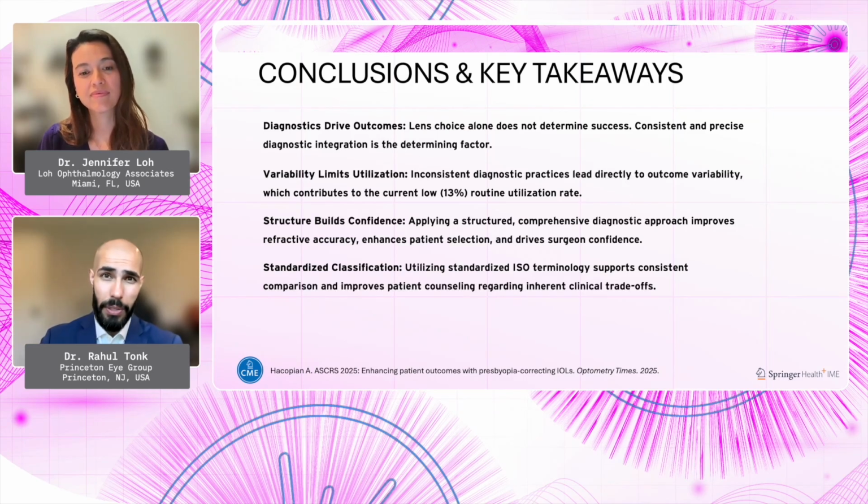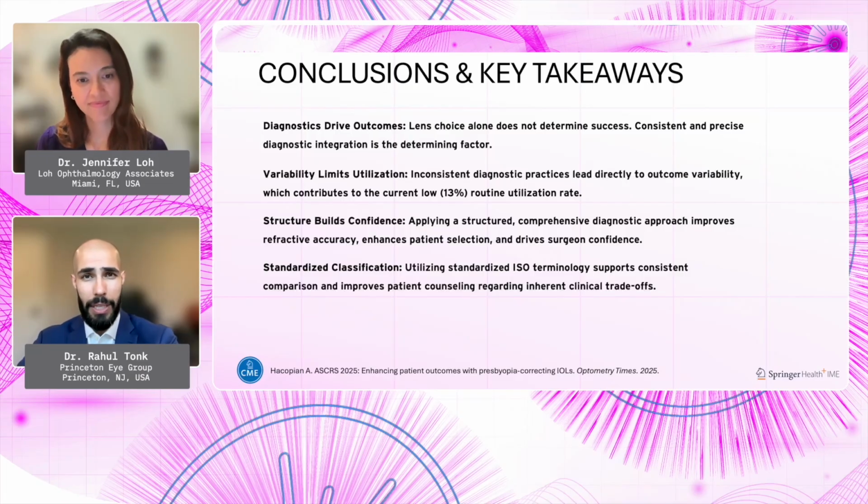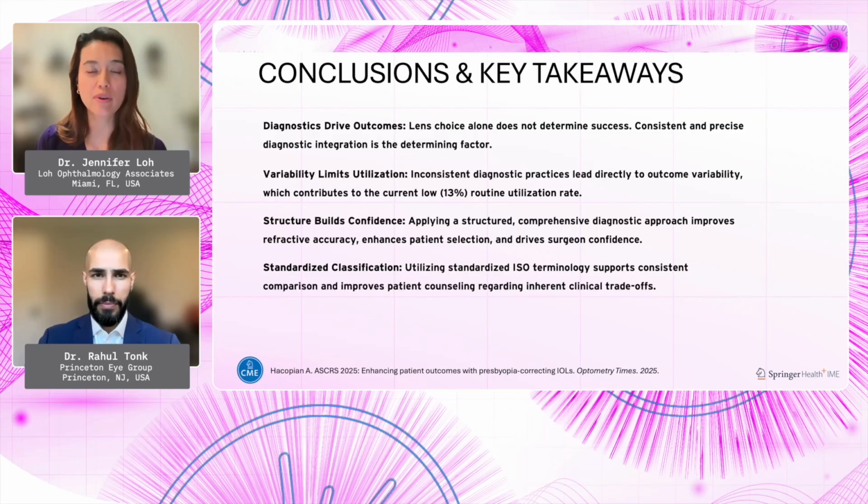But having the comfort to do it, and having the patient know, as you discuss some of the trade-offs with presbyopia correction, that they have, in a worst-case scenario, the ability to replace that lens implant, of course with all the attendant risks of going back to the operating room, that will allow comfort on the part of the patient and certainly comfort on the part of the surgeon to be able to offer these lenses. I absolutely agree. It's very comforting to know and feel confident that you can help the patient. So learning the intraocular lens exchange is very critical.